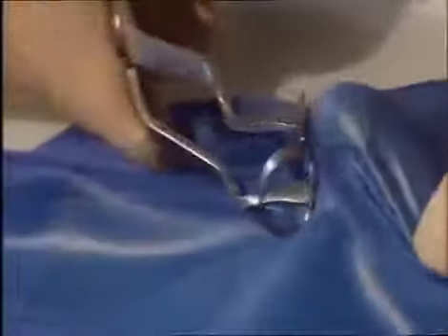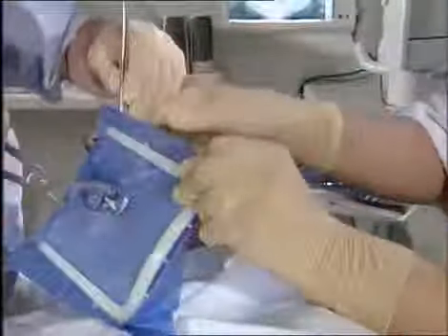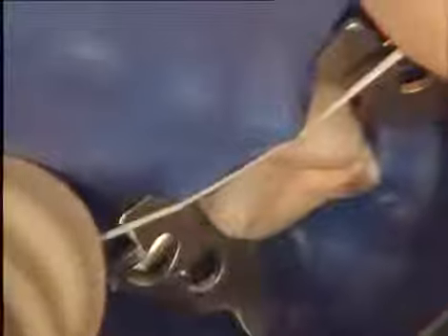The rubber dam clamp should demonstrate a firm fit without traumatizing the gums. In case of latex allergies, a non-latex rubber dam is available. In order to seal hermetically, the rubber dam has to be pushed through the interproximal contact point. There are clinical situations in which continuous minor leakage may occur. These often can be blocked with, for example, Cavit or oral seal caulking.